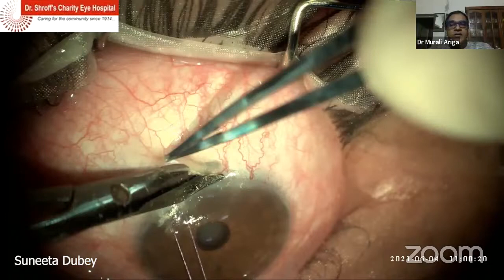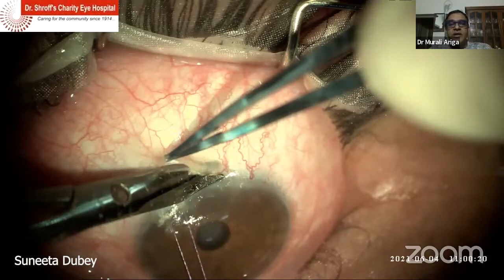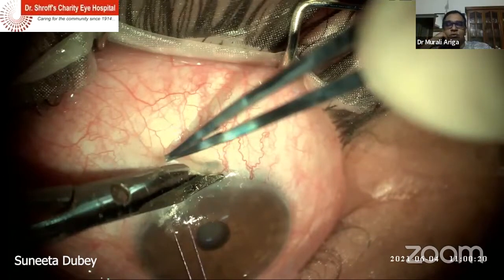Actually, we have been using superior rectus suture for so many decades. Only now recently we have switched over. So the points for those who still use superior rectus are to use an eyeless needle, not the needles which have the eye and are threaded, since that causes traction on the rectus, and to take the round body needle and not damage the superior rectus. Many patients, if you have a good speculum, you probably don't need anything. They simply operate without any traction suture or superior rectus. But I think for the beginner who is learning trabeculectomy, some kind of traction suture is better, either superior rectus or corneal.